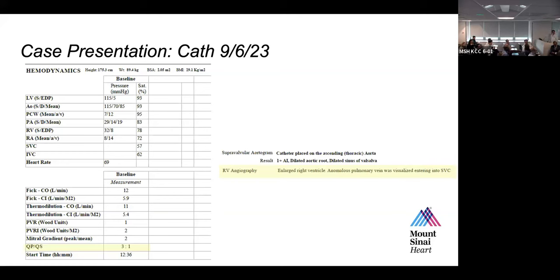Or you can review the limitations of the oxygen saturation machine we use in the cath lab. That's right, exactly. There is actually data that came from Boston Children's, maybe 10 or 15 years ago now, that shows that cath calculations and MR calculations correlate pretty well. And so when they don't, usually we go back to one of our calculations and figure out what went wrong.